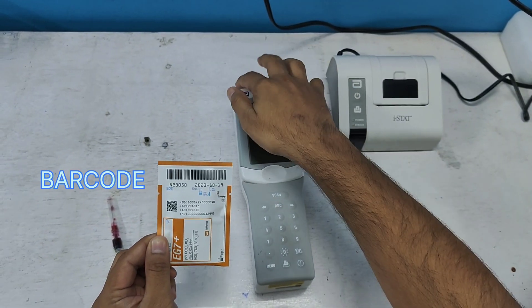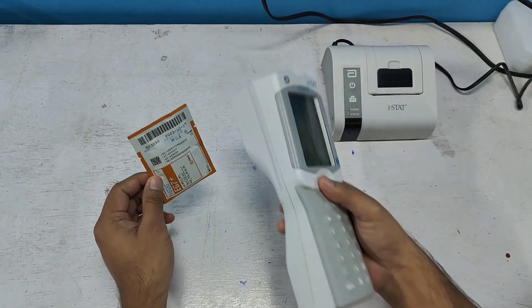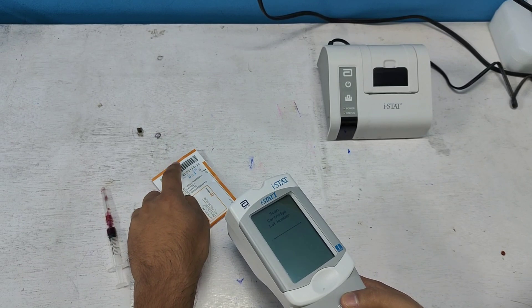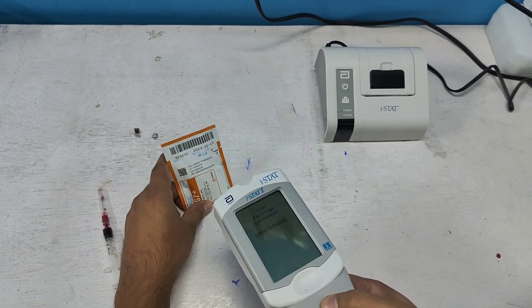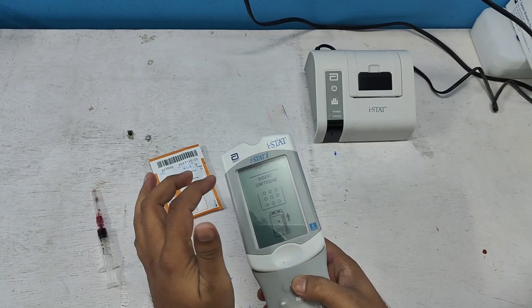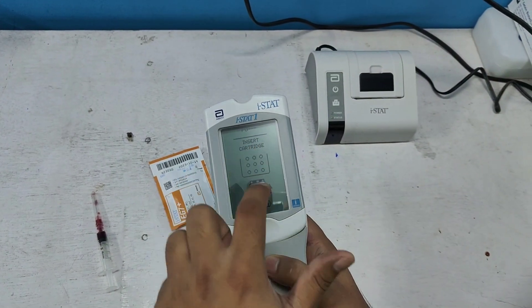We scan the barcode using this machine. Let's scan — this is the scan button. Scan the barcode. As you can see, the barcode has been taken. The machine now says to insert the cartridge.